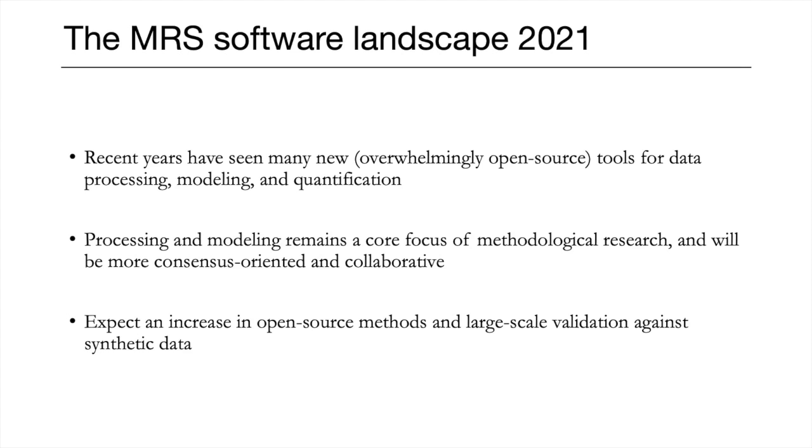Unlike the fMRI world, the MRS field was not big on open source for a long time, but as consensus emerges, new developments for processing and modeling tend to become more collaborative. So expect that even more tools are going to be released, particularly involving validation against large-scale simulated datasets and deep learning-based analysis methods.